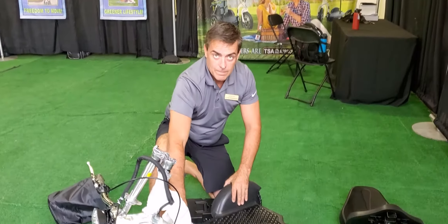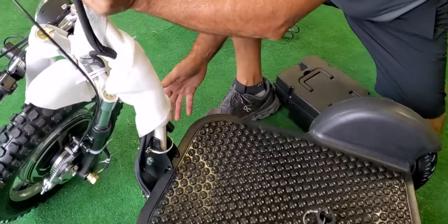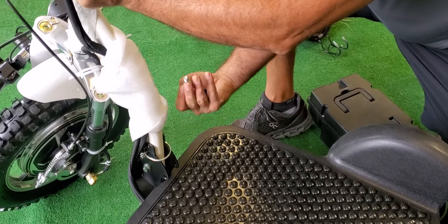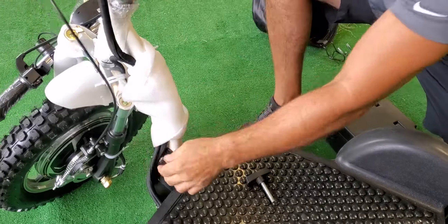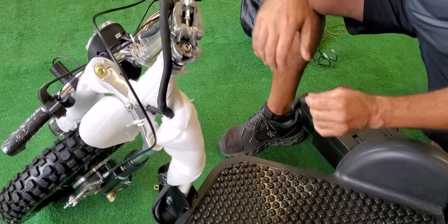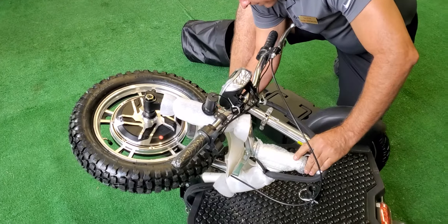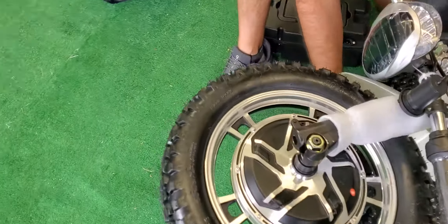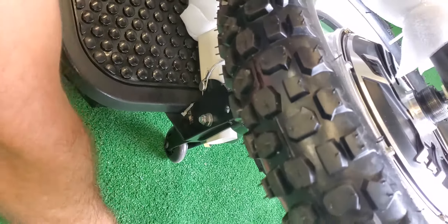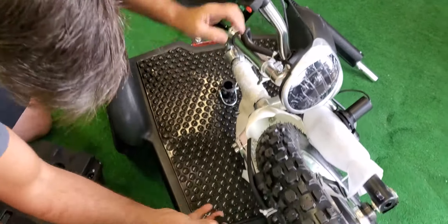Now there's a small knob right here — you're just going to loosen this knob. Sometimes you might want to push forward a little bit to take some of the pressure off, and then that's going to bring that knob right off. Then you've got one more cotter pin right here. Bring that back and this will fold down. After you fold this down, take the cotter pin and place it back into the hole right over here. For the knob, put that back into the actual hole it was in, just for storage.